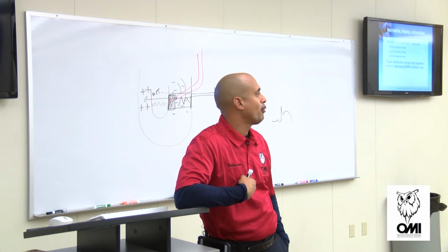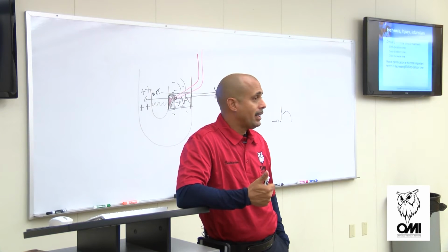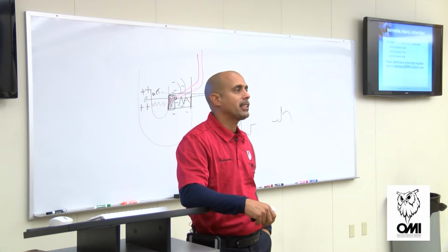So why are we trying to rule these out pre-hospital when we shouldn't? But if he's symptomatic and he has ST elevation, do I need troponin? Yeah, it's probably going to be positive, but do I need that to say, hey, this is an MI? No, because I already know it's what?